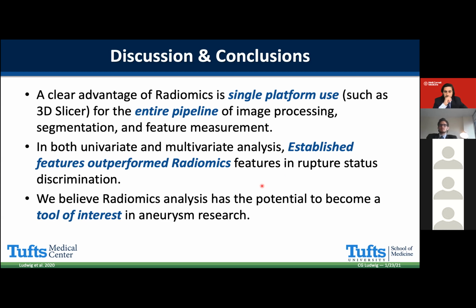Still, we believe that with some tweaking, with some adjustments, with some improvements, those radiomics features do have the potential to become a tool of interest. Perhaps we can get them to a better predictive influence. We can improve their predictive power in deciding whether or not an aneurysm is ruptured or not.